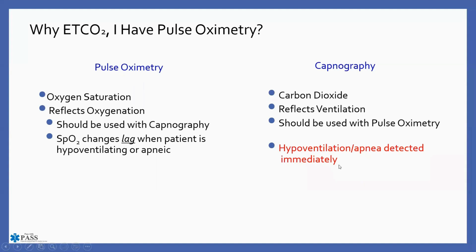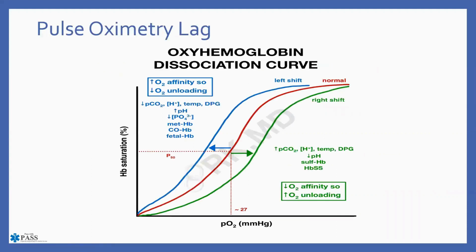Hypoventilation and apnea is detected immediately. And it really, truly, if you try this, and I challenge you to do that, go out to your bay, put yourself on nasal capnography and breath hold. And what you will see is it is literally one breath behind if you do that experiment internally. All right, so this is a slide on pulse oximetry lag.